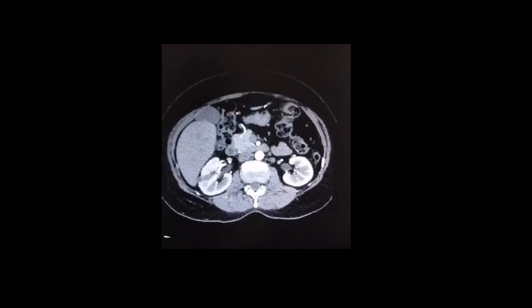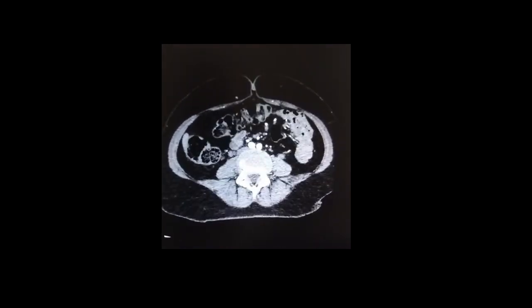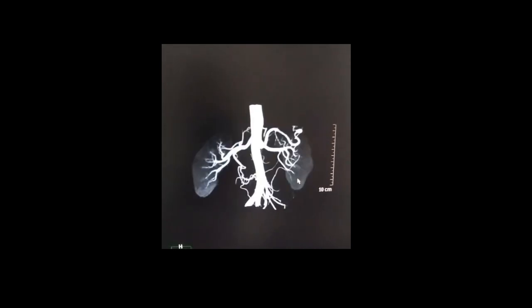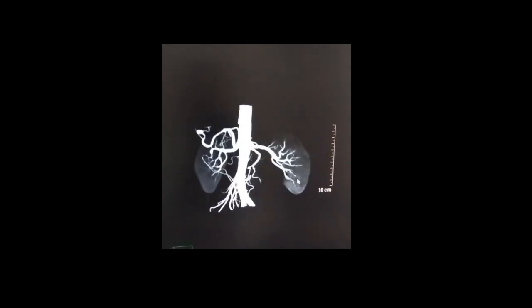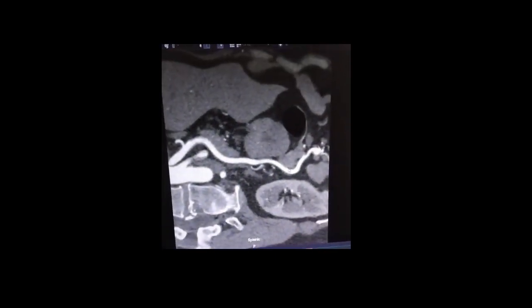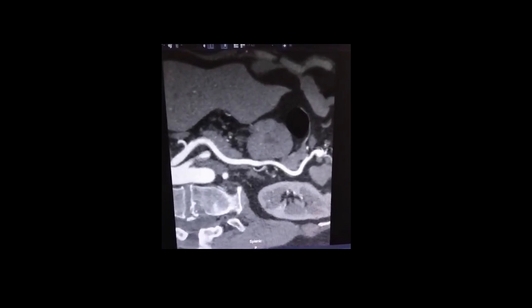2. Late arterial phase, 35 to 45 seconds. Description: continued arterial enhancement, with more uniform and intense arterial visualization. Image features: complete arterial tree enhancement, with some early parenchymal enhancement. Application: useful for characterizing hypervascular lesions like hepatocellular carcinoma.